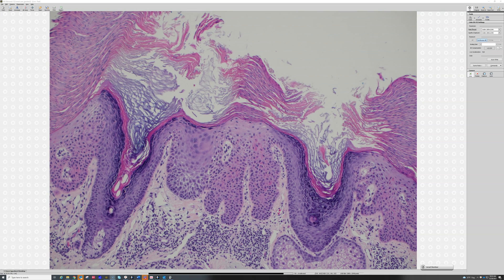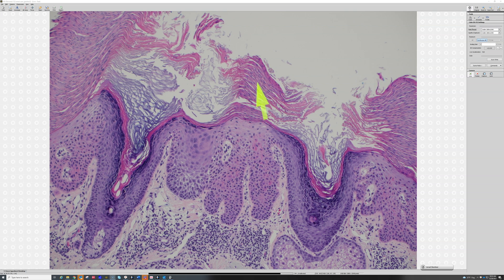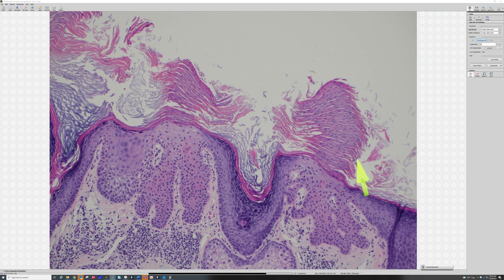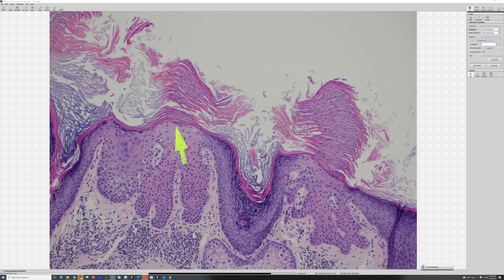Then you go back to that dense, compact, pink parakeratosis. For anyone new to dermatopathology, parakeratosis means nuclei that are retained in the corneal layer. Normally the stratum corneum is loose, flaky, dead keratin without any nuclei, but the nuclei are retained here. Parakeratosis is a sign that the epidermis is growing too quickly — normally cells go from the basal layer up to the top of the epidermis and then die and turn into stratum corneum.